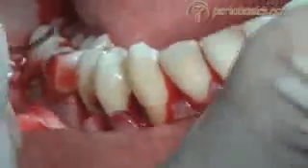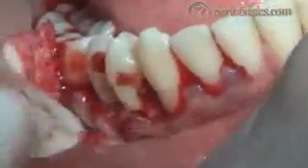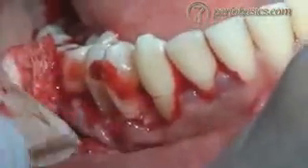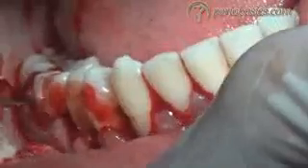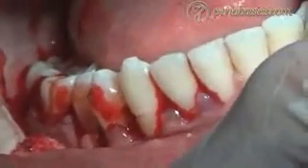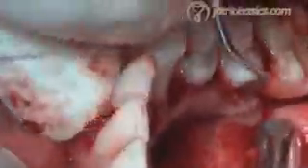And then we start with the removal of the granulation tissue with the help of curettes. So all the granulation tissue in between the teeth is removed, and as we have complete access to the root surfaces, the root planing is also done. And the same procedure is repeated on the lingual aspect. From all the interdental areas the granulation tissue is removed.